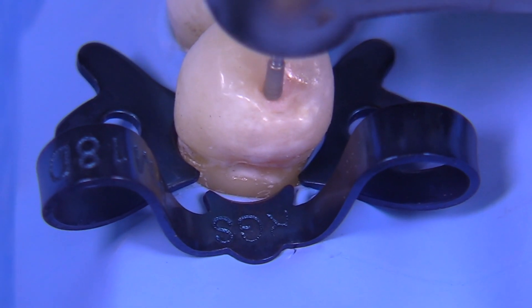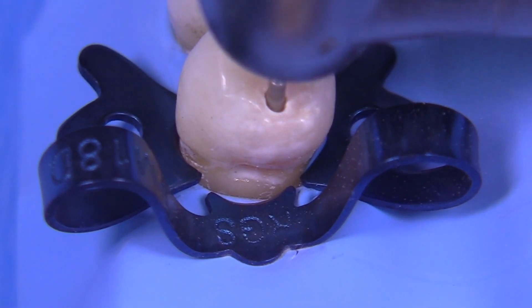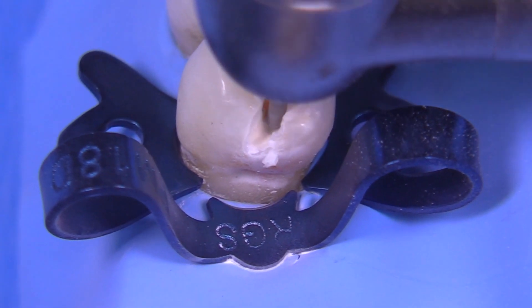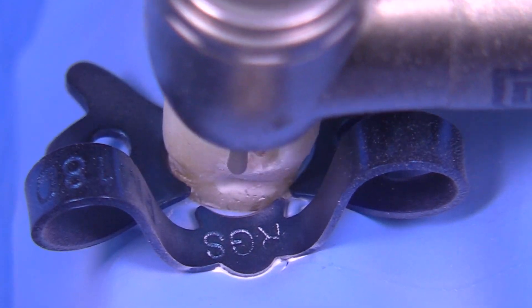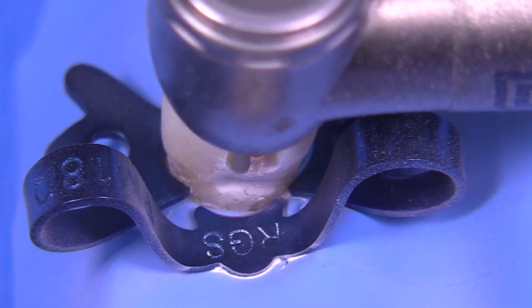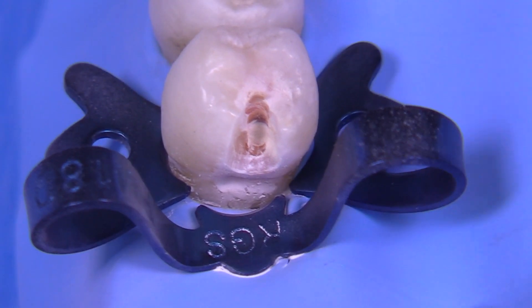It's truly a wonderful thing to be able to get behind a tooth and yet still keep the rubber dam pushed down out of the way. I'm doing this with the water off because this is an extracted tooth mounted in the Typodont, so don't panic — I always use water — but I'm doing this dry so you can see better. I'm making a preparation that's like a class 2 extending down gingivally to seek out the caries located on the occlusal and deep into that gingival third root surface area.